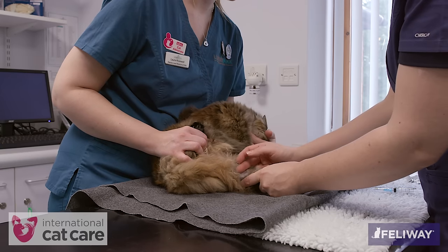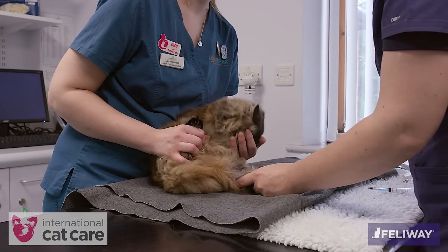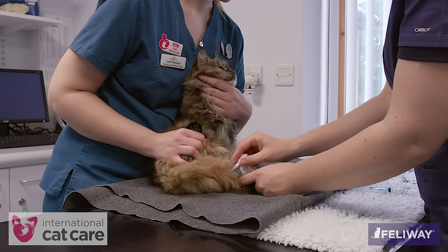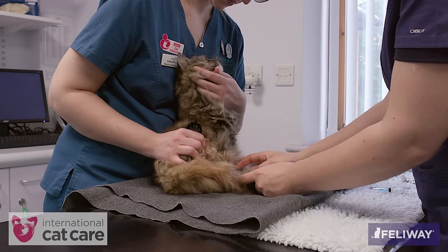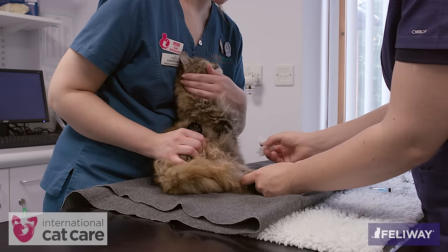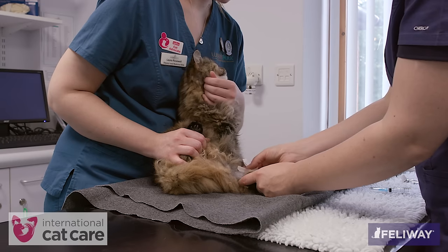The hind limbs are not overextended and gently directed towards the person taking the sample, who restrains the lower leg. The assistant gently holds the cat against her body and the other leg out of the way. She continues to stroke and reassure the cat whilst the vein is raised and the catheter placed.